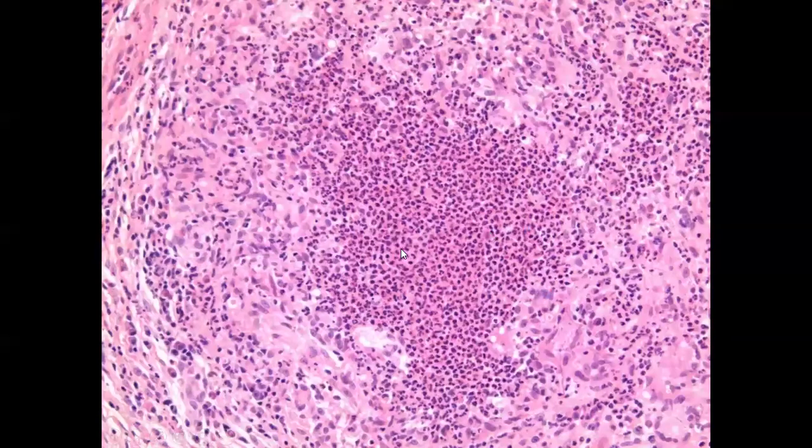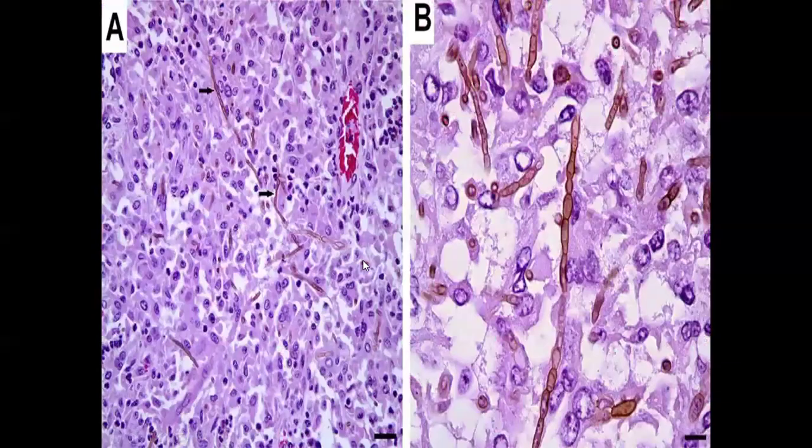The histopathology is that of suppurative granulomas. There is lots of neutrophilic infiltrate with surrounding granulomas. Within the neutrophilic infiltrate, you would see these fungal hyphae. These are large hyphae, and they are visible even without doing a special stain. So this is phaeohyphomycosis.